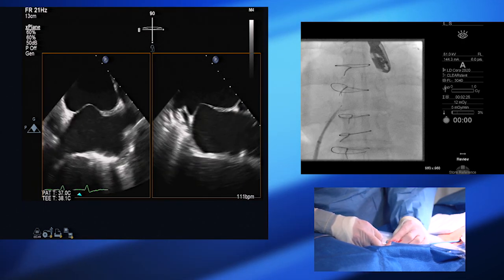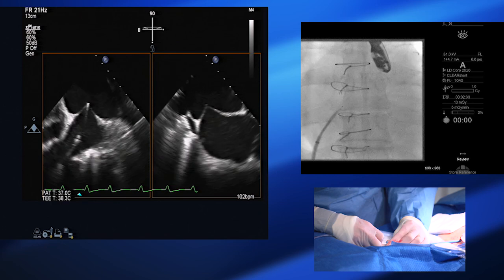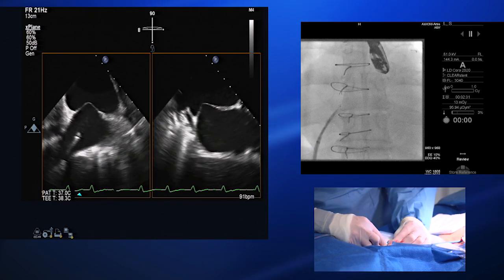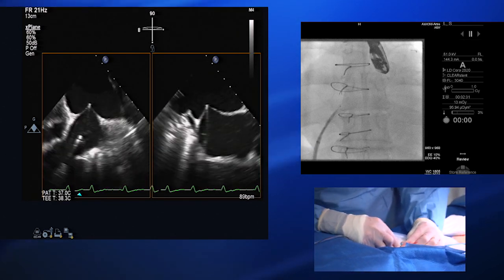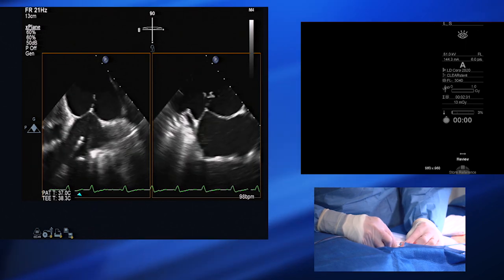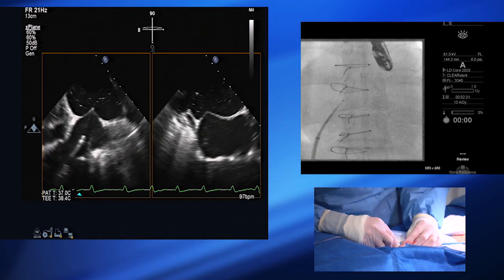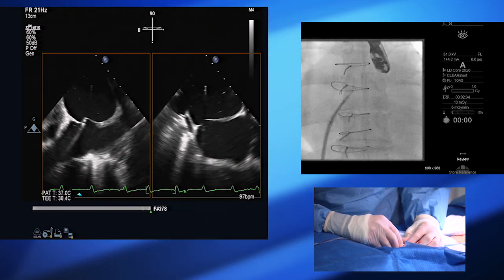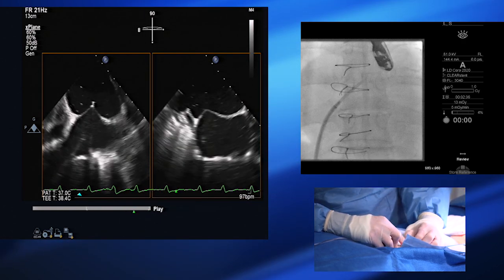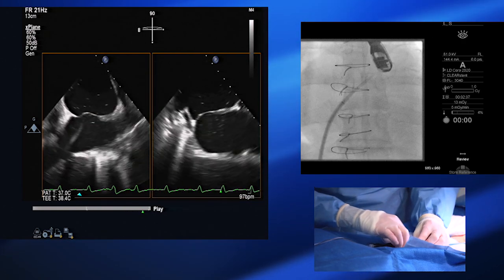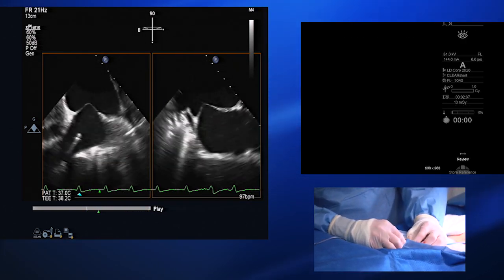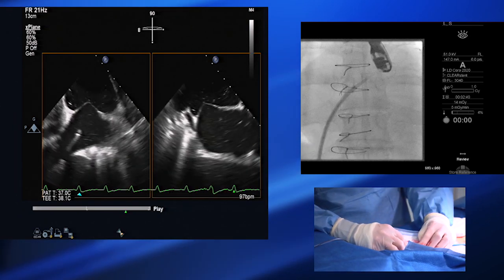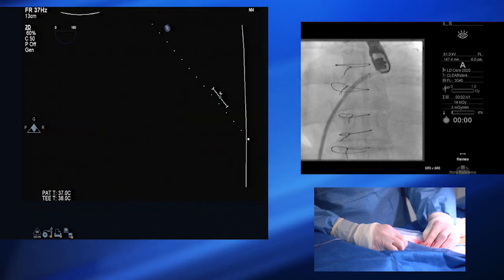I'm just getting the Baylis needle out of the tip of the catheter. Okay, we're ready to ablate. That's across. I'm going to advance everything together — the dilator and sheath — and then the dilator alone.